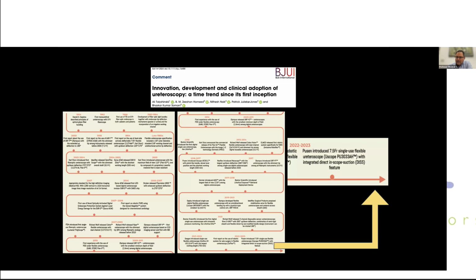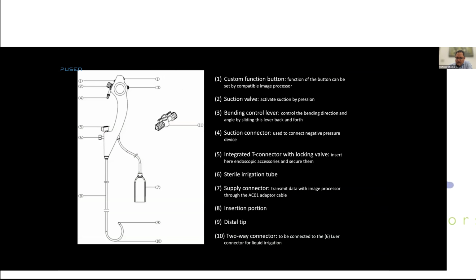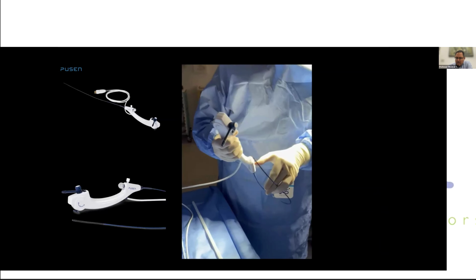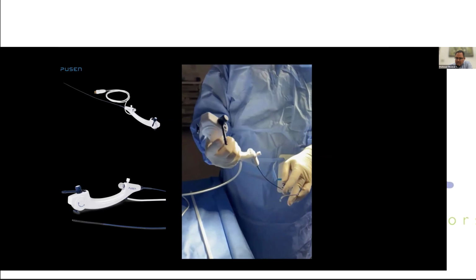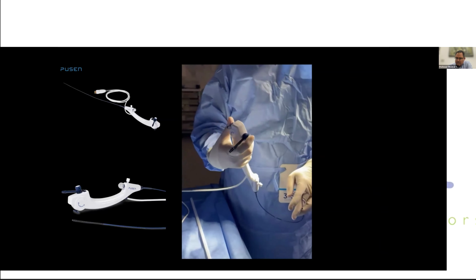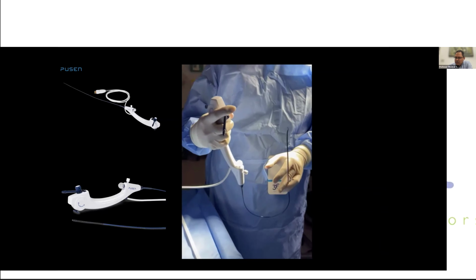And hopefully, the future will be with different sized suction ports or having wider channels for suction. In terms of ergonomics, Ananda has shown the suction cystoscope. This is no different. You've got the handle, you've got the working port, which is attached, the fluid connector. So it is very similar, except in terms of the design, to the suction cystoscope. Now here you've got the port there, which is for the fluid management. You've got the working port for the laser. You've got the suction button, very similar to the cystoscope, and the deflection at the back. So these are similar to what you're used to.